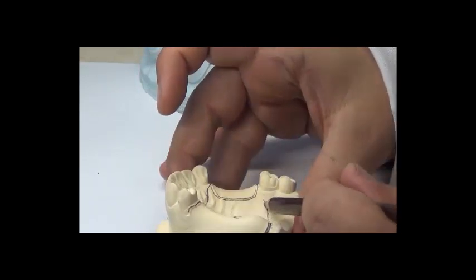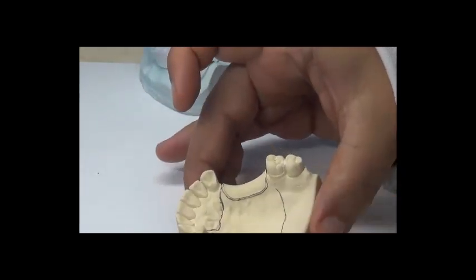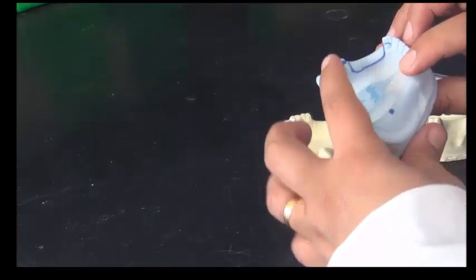So we're going to fill in the beading line, the posterior beading line, and the anterior beading line with wax. For the lower, we're going to do the same step, and you can find that we're going to fill in these layers here, lingual and proximal as well. Okay? 10 minutes to do this step.